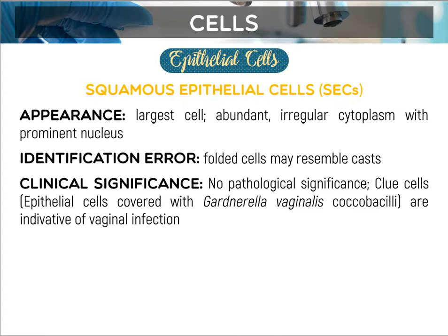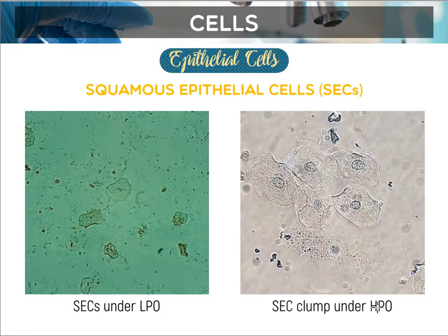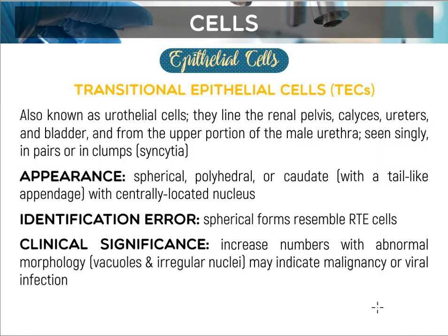All right, so it is reported in terms of rare, few, moderate, or many, okay? Later on I will give you a mnemonic so that you won't have difficulty in your reporting. So we have it under LPO and under HPO.